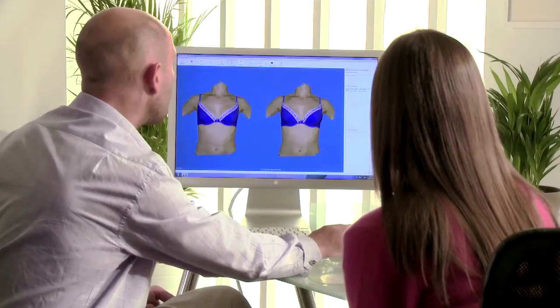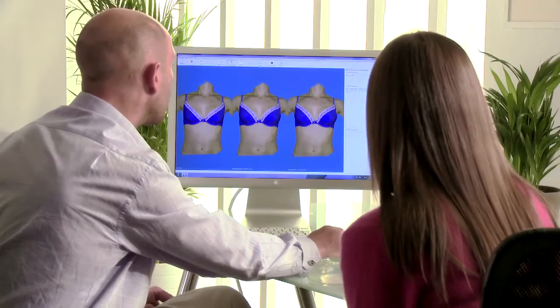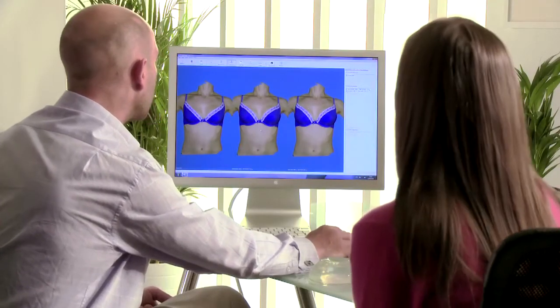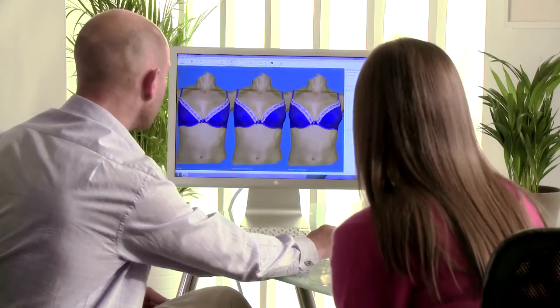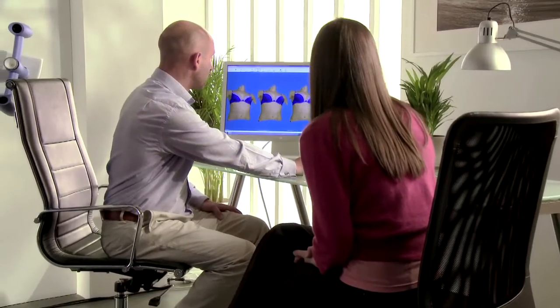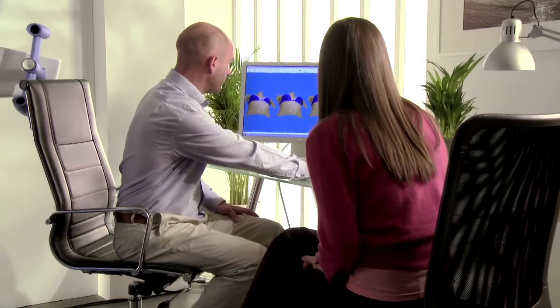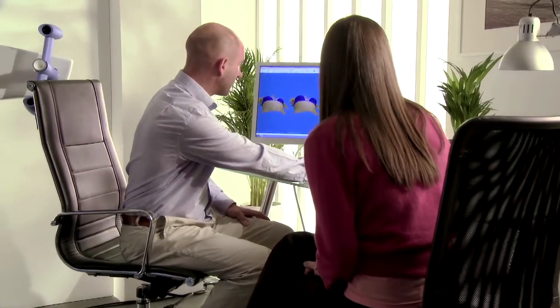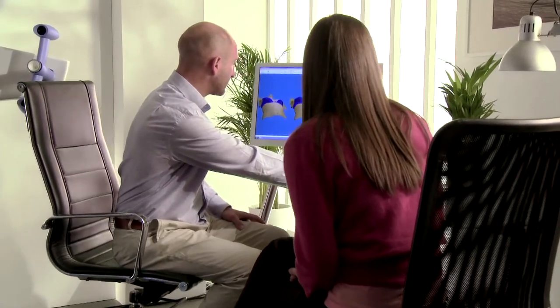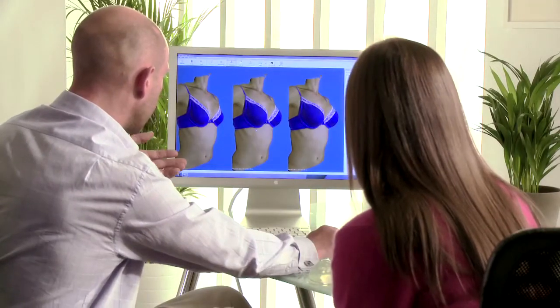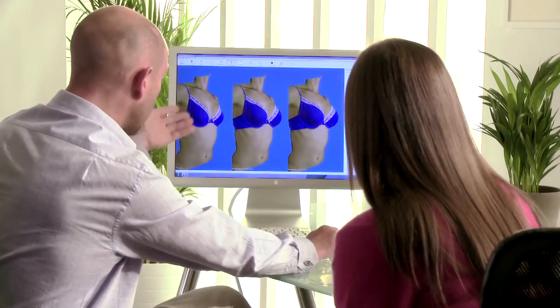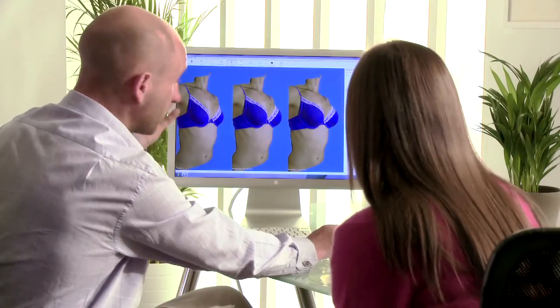Multiple simulations can be created quickly. Show and compare how different implants react within the body, viewing as many as six options on a screen at one time. Visual differences become very obvious, making the consultation more efficient, requiring less time and fewer resources.